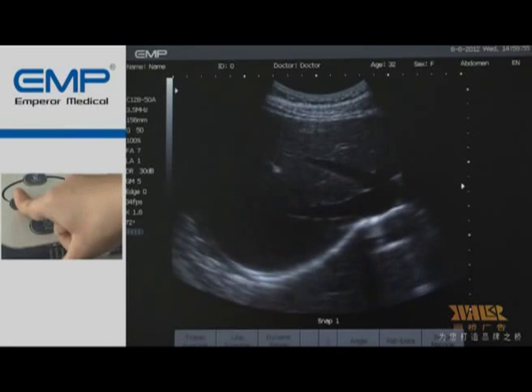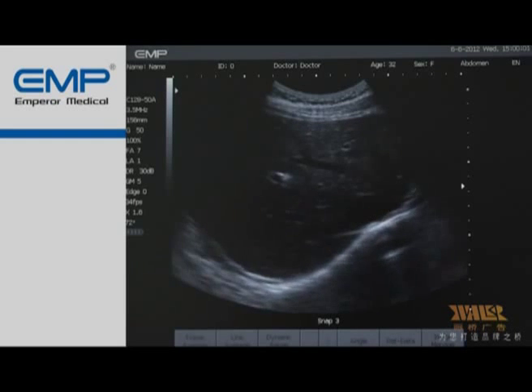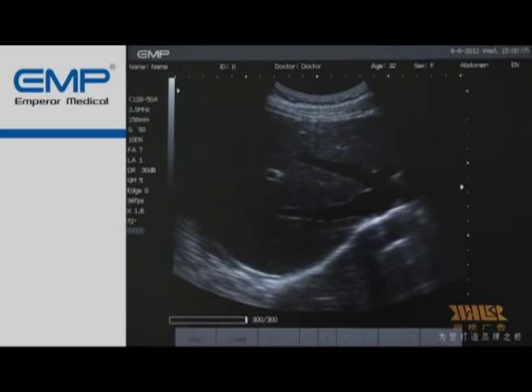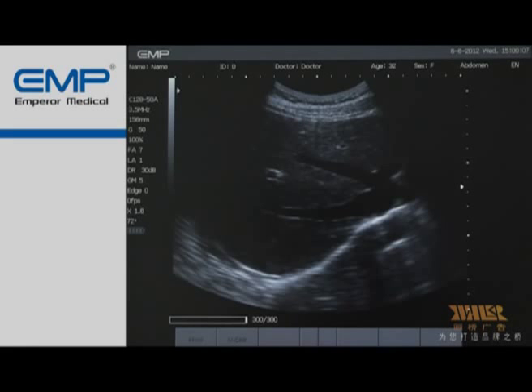Press Snap and the system will save the image to the host, with a maximum of 16 images. All snapped images will be deleted when you switch to a new patient. Press Save, displaying this menu on the screen. Press F1 to save the image to the host. The file name can be defined by either the system or the user. Save successfully. File name is X.